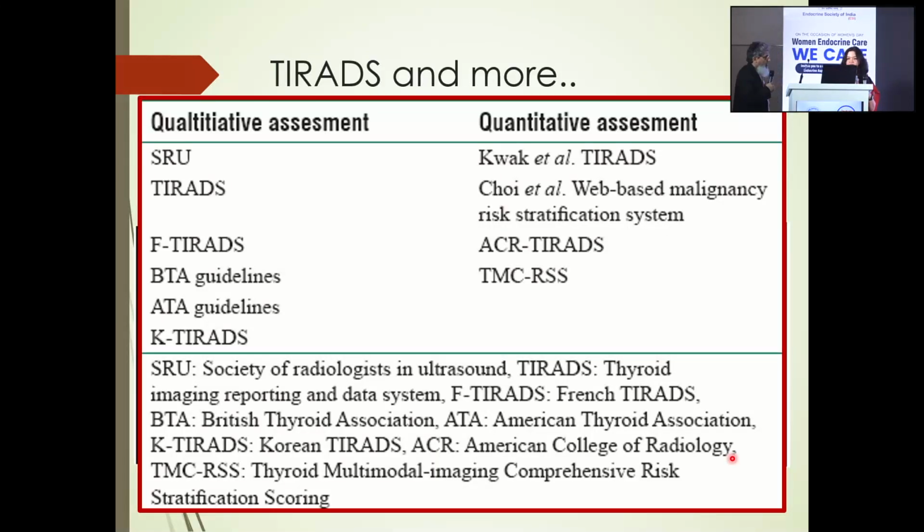So yeah, a little bit about the TIRADS if you want me to add. I think TIRADS has been evolving over a period of time, and there is a European TIRADS as well. So TIRADS is what we use. There is French TIRADS, there is a Korean TIRADS. These are the two additional ones which we use.